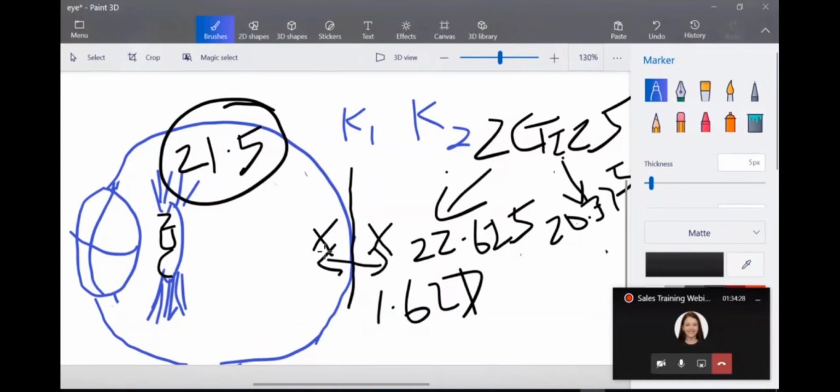If you align the lens correctly in the eye, it's going to bring your two focal points much closer together. So toric IOLs help us to correct the astigmatism by giving you two different refracting powers on the lens, to bring the two focal points closer together.